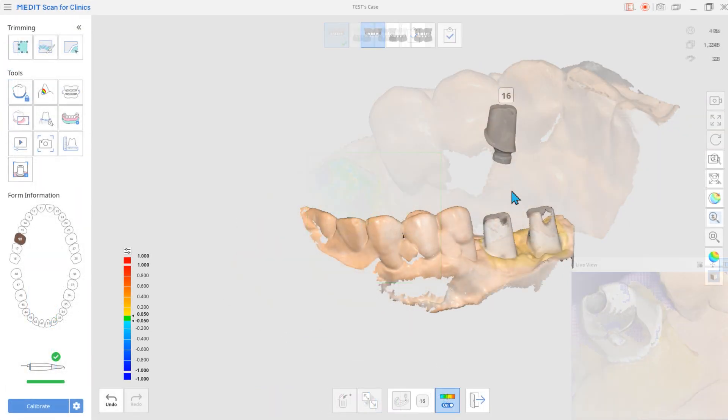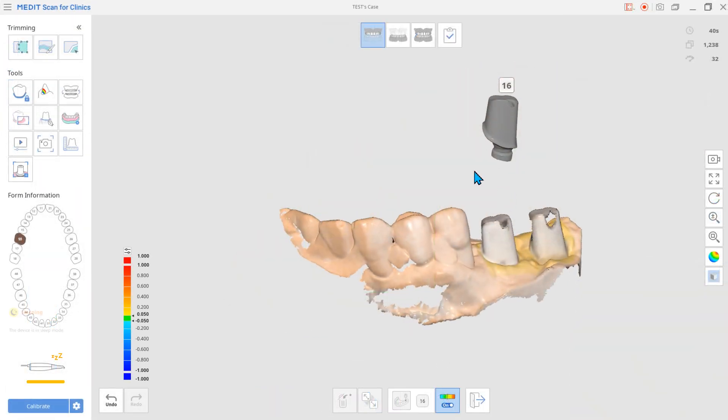You can also align manually if it does not automatically align or if you want to realign.